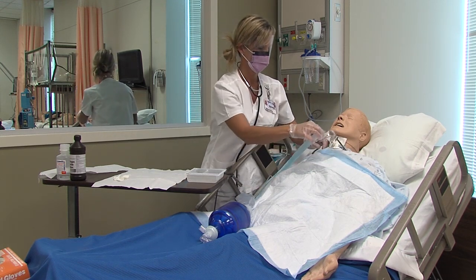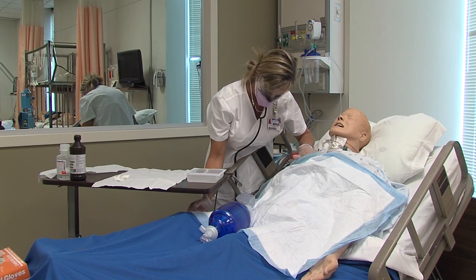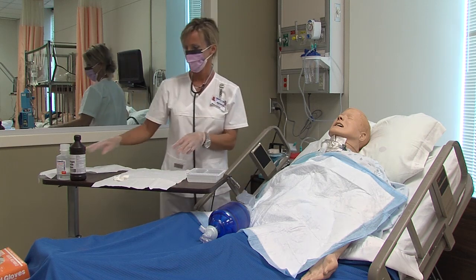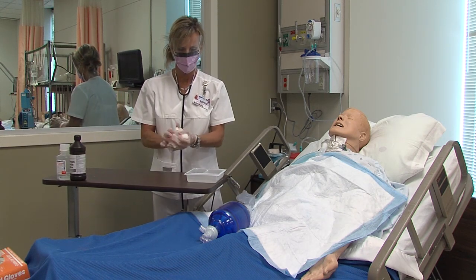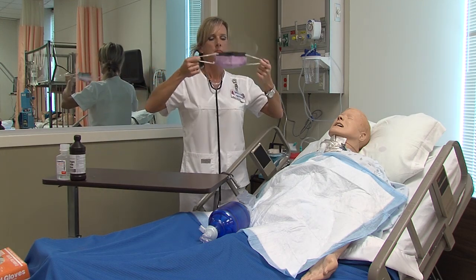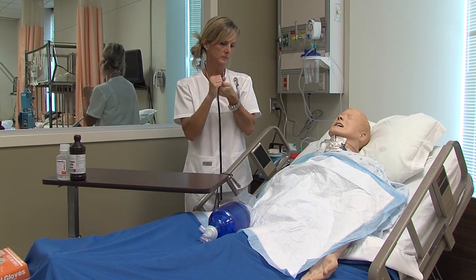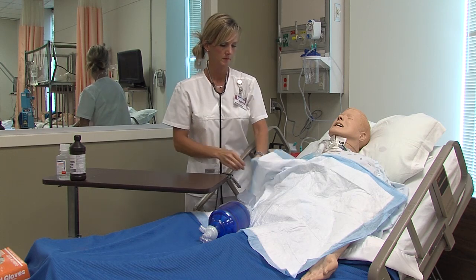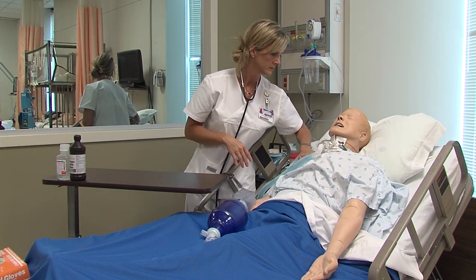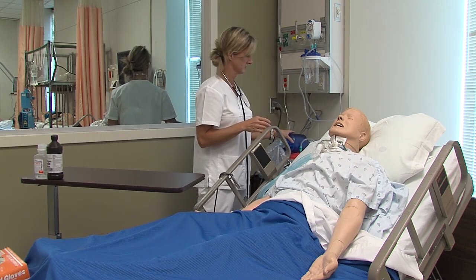Replace the trach collar. Assess the client's oxygenation and respiratory status. Suction if needed. Dispose of all used equipment in the biohazard bag. Remove mask and eyewear. Perform hand hygiene. Ensure that your patient is safe and in no distress. Document the procedure. Conduct final hand hygiene.